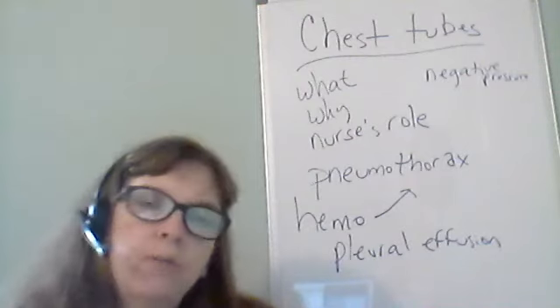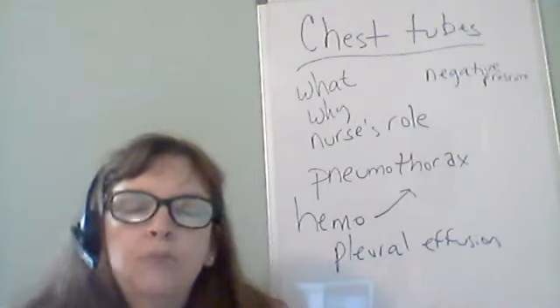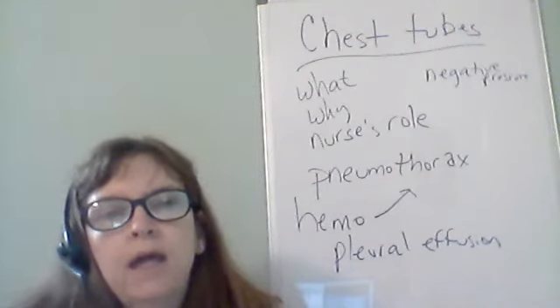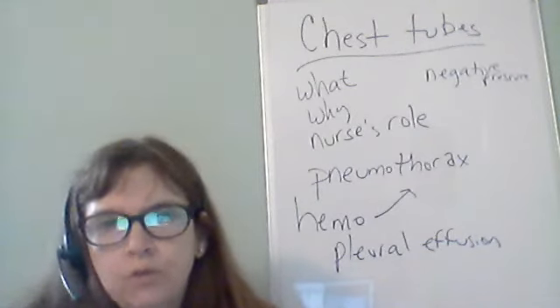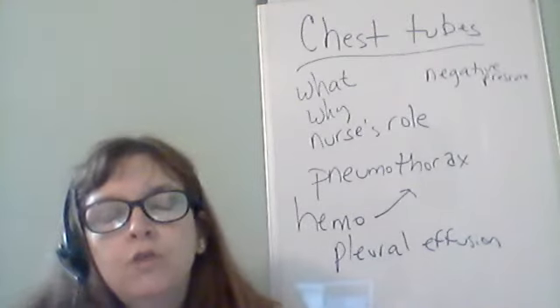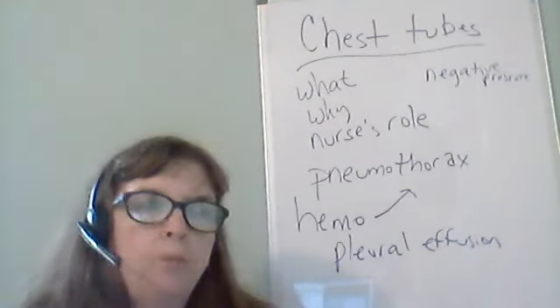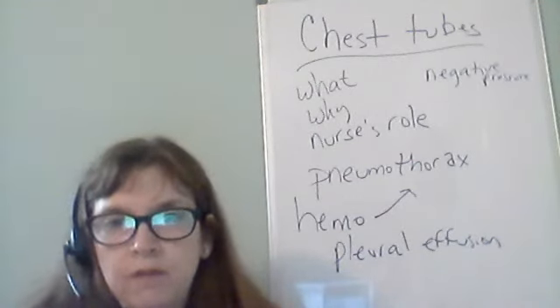Hi, I just want to talk to you about chest tubes for a few minutes. We're going to talk about what the chest tube does, which patients get chest tubes, and a few other things like the nurse's role in managing a chest tube or assisting with insertion. The chest tube is designed to help maintain the negative pressure of the lungs.